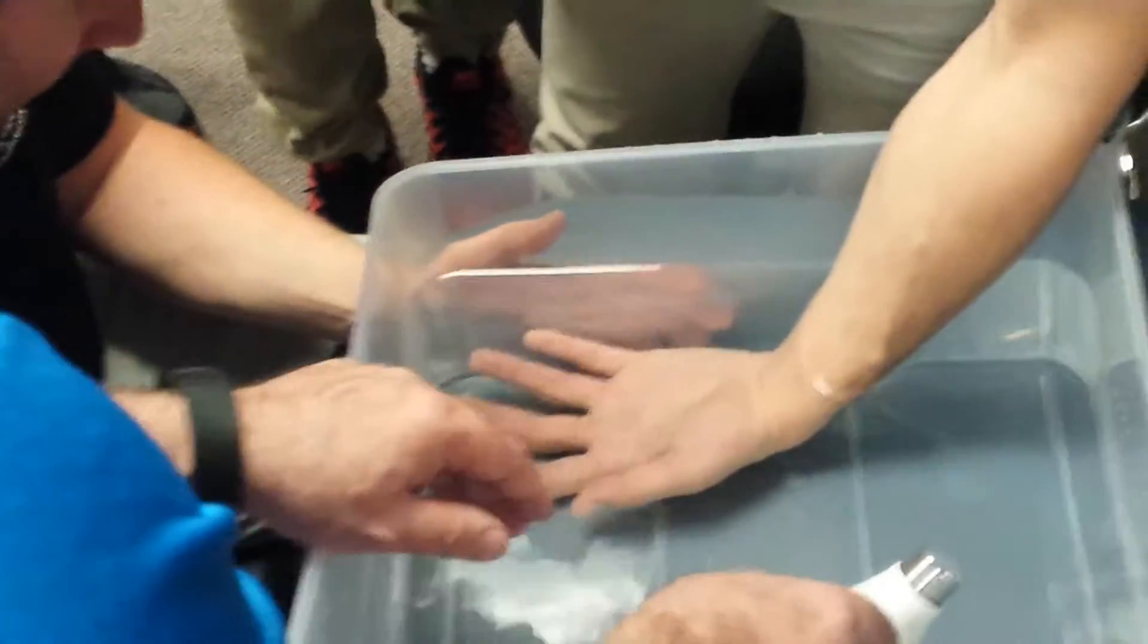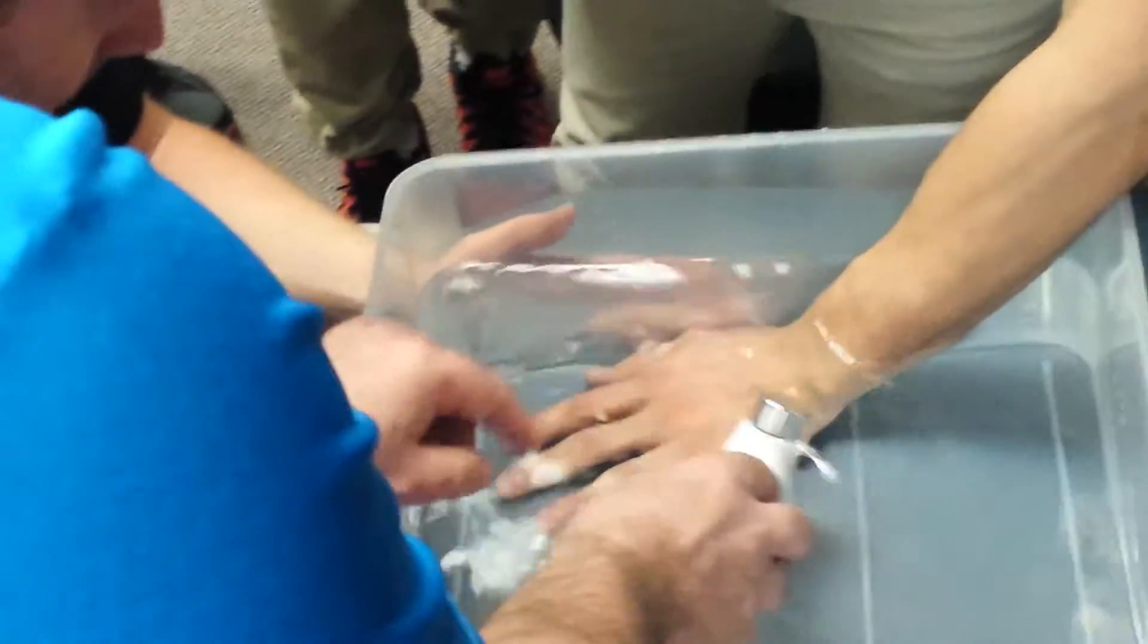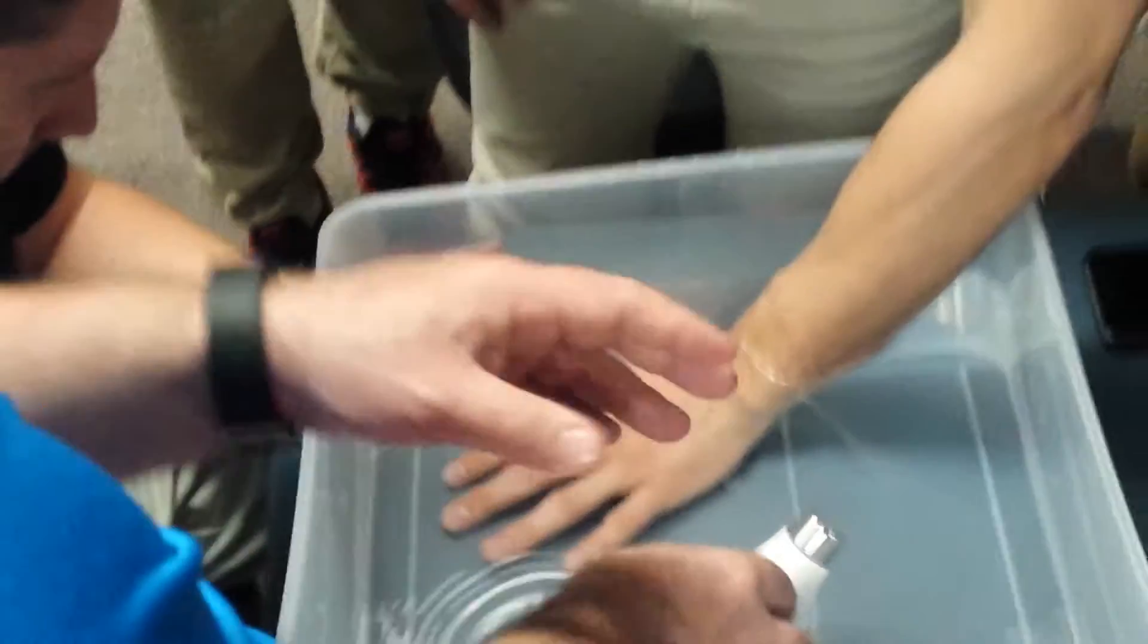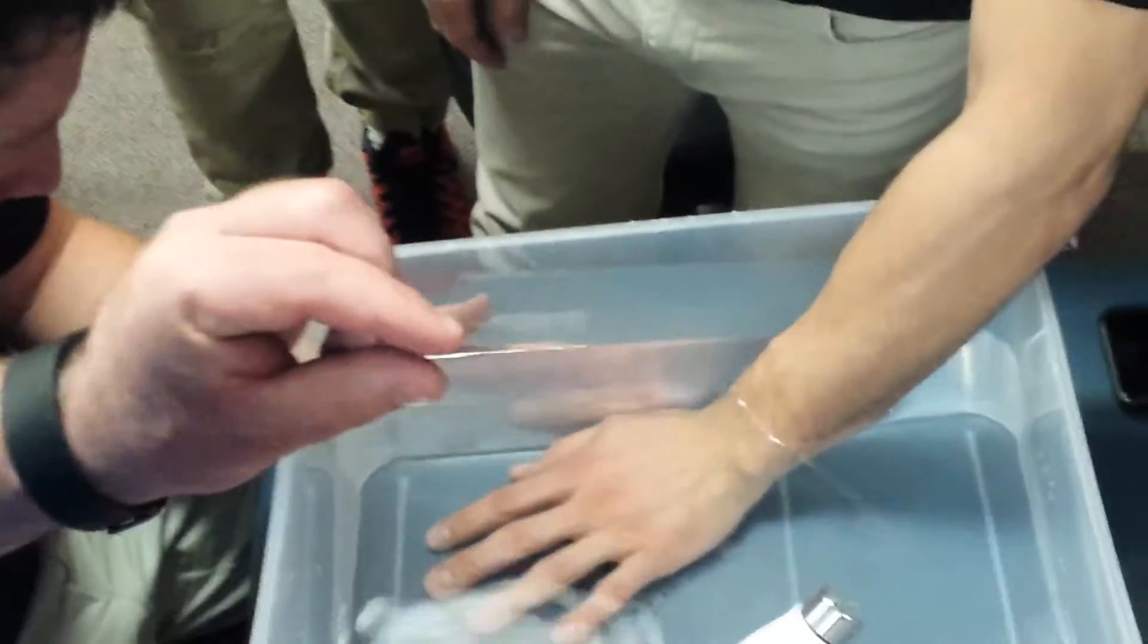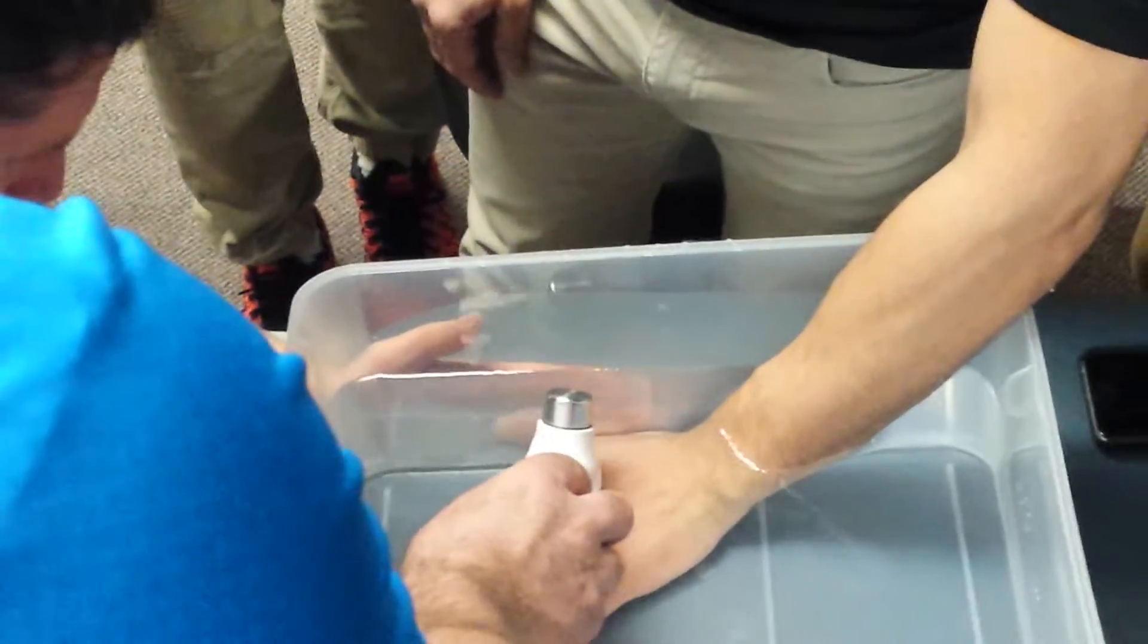So let's just flip your hand over. Cool. So let's say he has pain on the back of his hand. I can do it here. Because if I was doing it with just the gel, I'm not going to have good contact surface. And that's the whole purpose of the gel. And I get great conductivity with just the water.